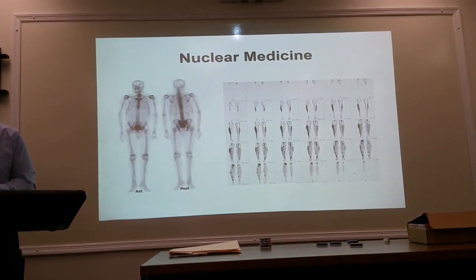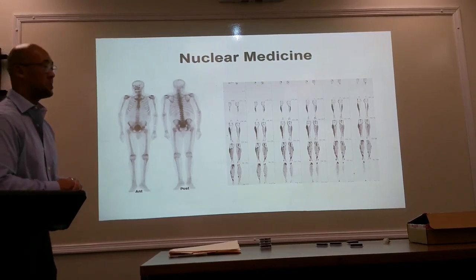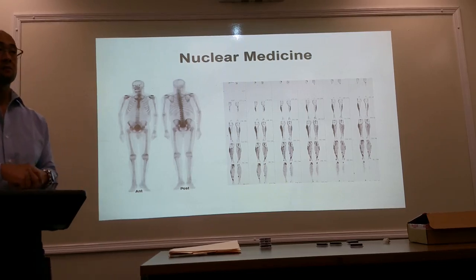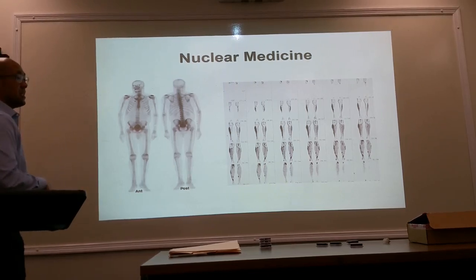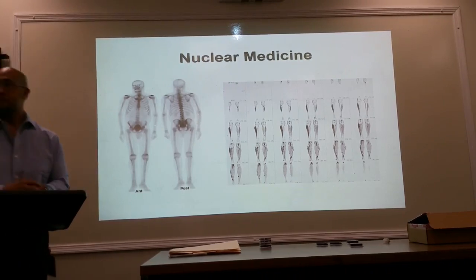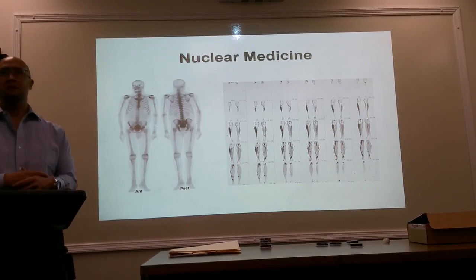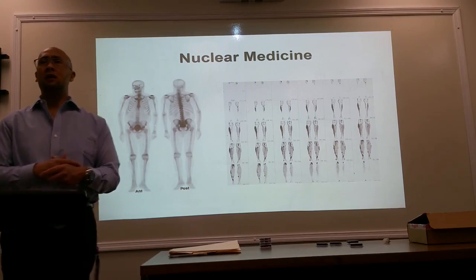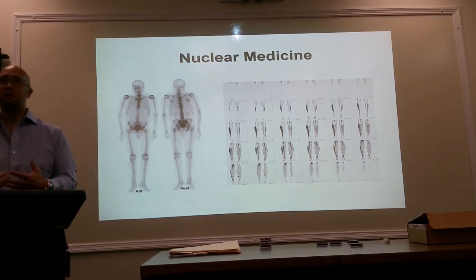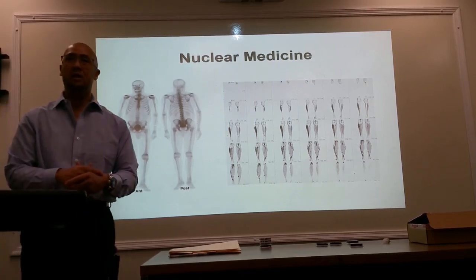Nuclear medicine is another way to study bone pathology. Not a good way to study bones itself, but this is a study of metabolism. This is good in detecting cancerous processes. Now, did we talk about nuclear medicine before, or do you have an idea of what nuclear medicine is? In nuclear medicine, we are injecting our patients with a radioactive pharmaceutical, so now they become the source of x-rays rather than us providing x-rays to get the image.